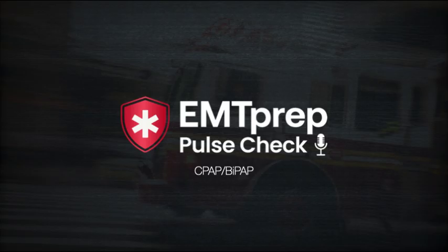The neat part about BiPAP is that we can actually adjust the tidal volume by increasing the inspiratory positive airway pressure and keeping the expiratory positive airway pressure the same. The ideal tidal volume for an adult is going to be anywhere from 6 to 8 milliliters per kilogram. Other places will tell you 6 to 7 milliliters per kilogram. It's generally going to be in that ballpark though, and it will be of the patient's ideal body weight.